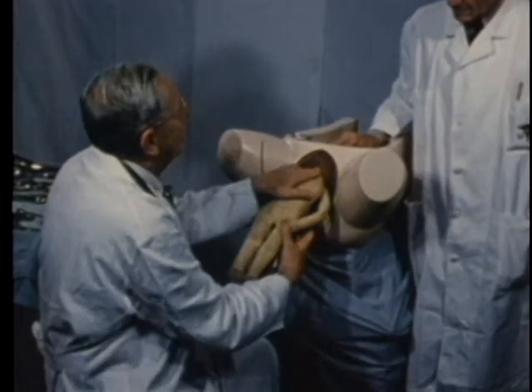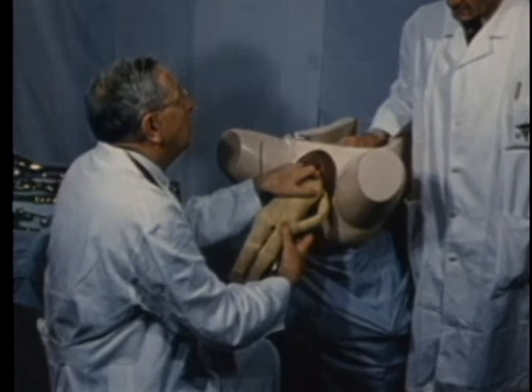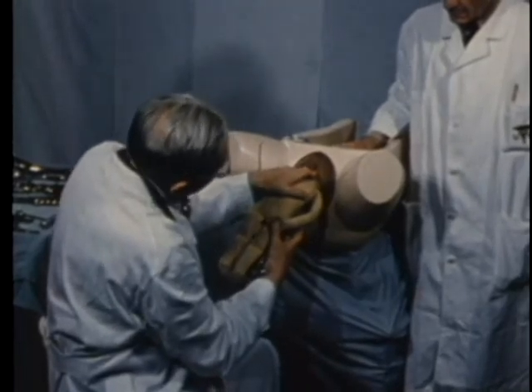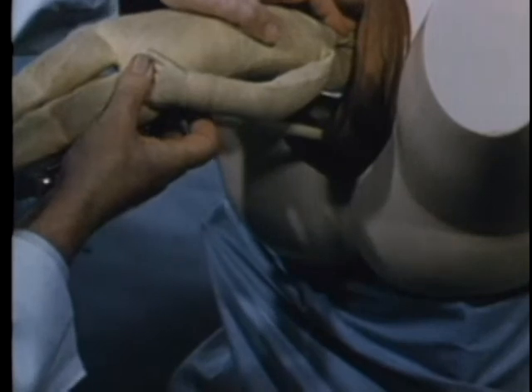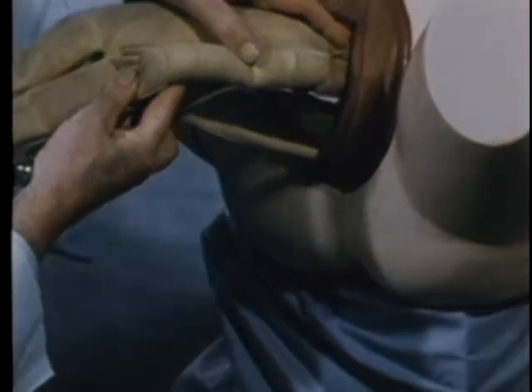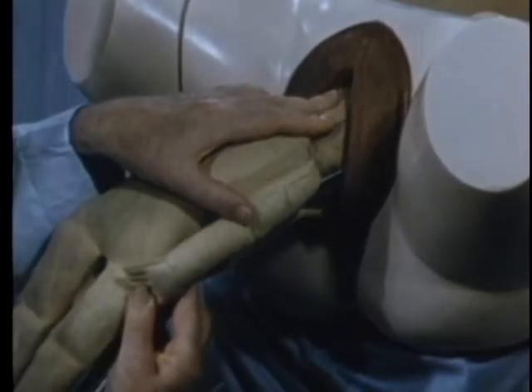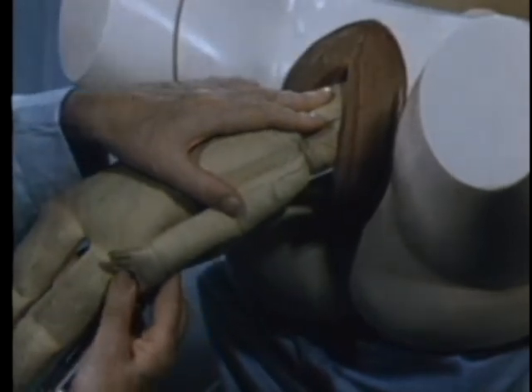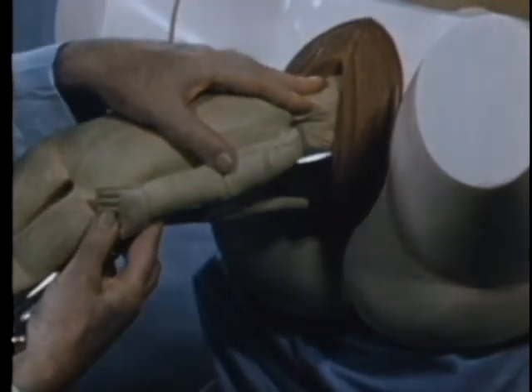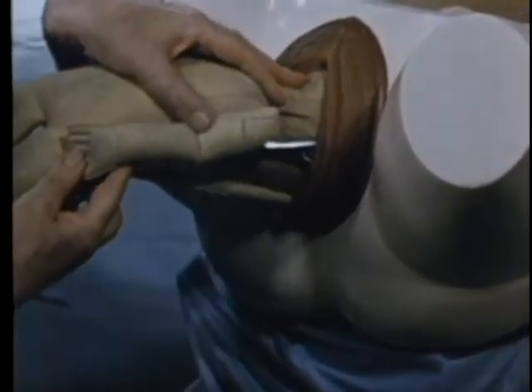Traction is downward with the left hand splinting the neck and the middle finger on the suboccipital region. Traction downward in the direction of the handles, then gradually elevating the handles to about the level of the horizontal, then lowering the handles in the pump handle maneuver, splinting the neck with the middle finger, bringing the suboccipital region under the symphysis. Gradually repeating the maneuver of elevation and depression with advance of the head, following each maneuver.